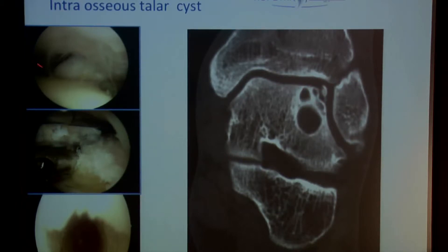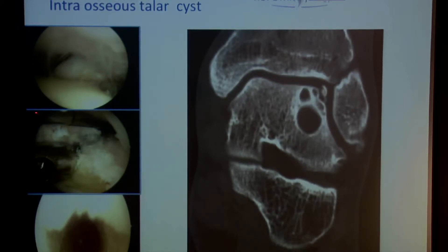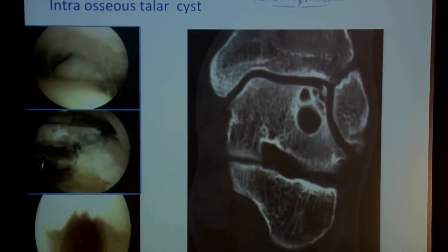Instead, arthroscopically with the posterior technique — not open — we open up the lesion, clean it, use our trocar to go into the defect, and in this perpendicular line we can go with our drill underneath the bone to enter into the talar cyst and fill it with bone to reestablish it. We try to be less invasive.